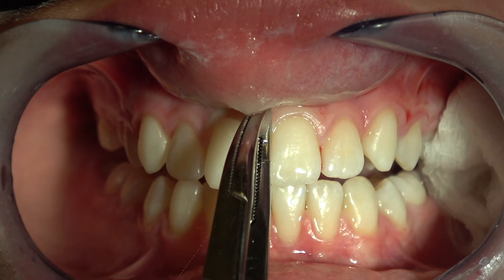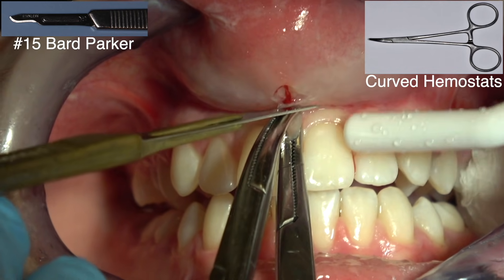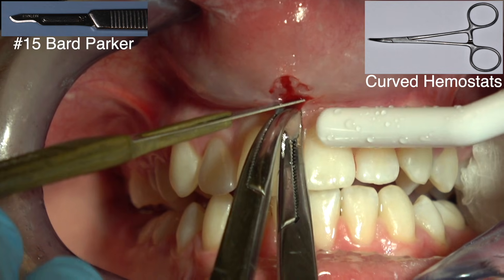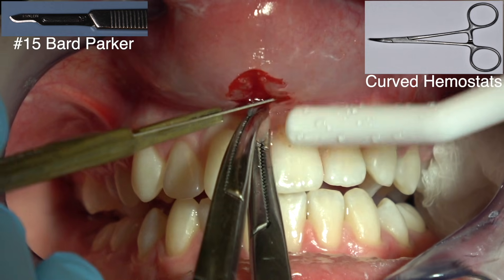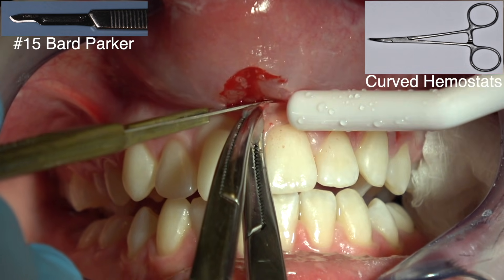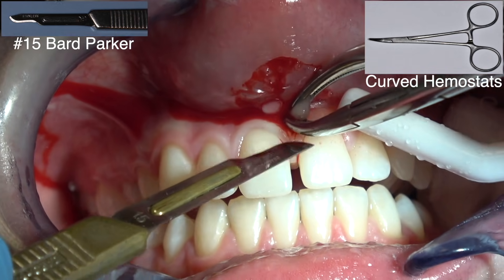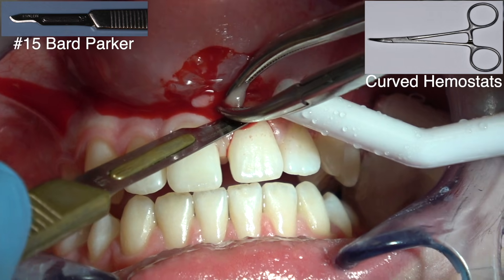You don't want to go in and just cut the frenum or it might grow back and it won't be a clean incision. So this perfectly guides you. Keep the tip of the Bard Parker — this is a 15 Bard Parker — on the hemostat. Keep the Bard Parker on the hemostat until you get to the tip of the hemostat. Then come back with the lower hemostat. Keep the Bard Parker touching the hemostat until it connects to your initial cut.